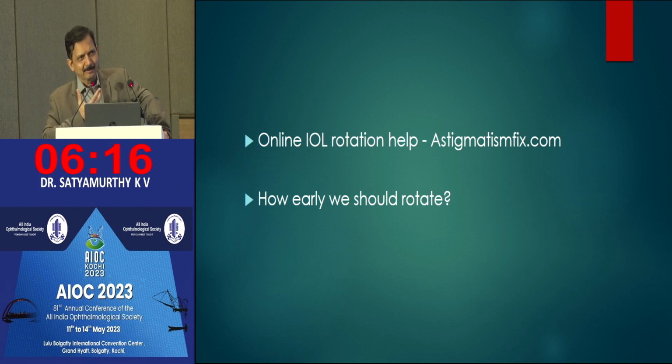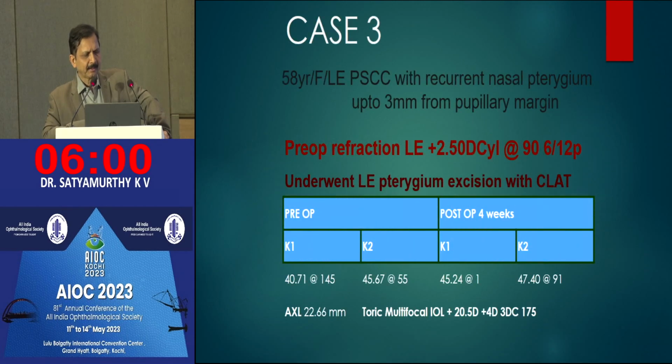So again, suppose a patient comes to you after 6 months, still we can go ahead and do it. The only thing is you will have to separate the lens from the fibrous capsule and then rotate it, so take all the precautions like that.